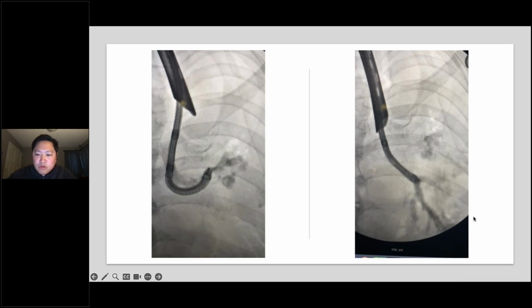But when you look at the left lower lobe, you can see distal airways. So how is this important? If you have left main obstruction, it may be worth opening that up, because you can open up the left lower lobe and maintain that for this patient, especially someone who's in respiratory failure.